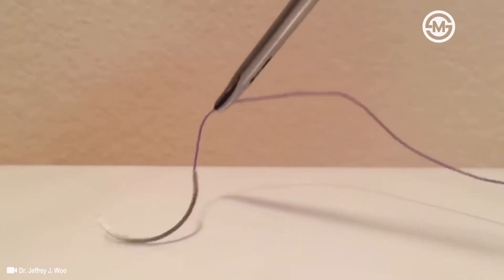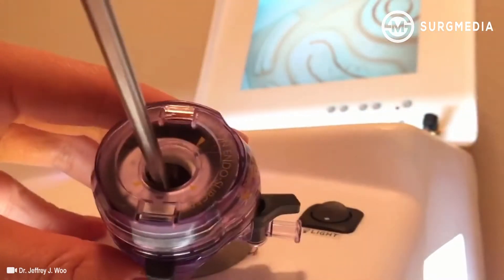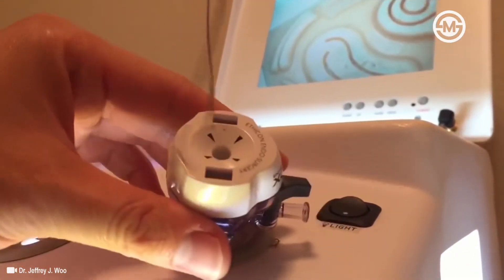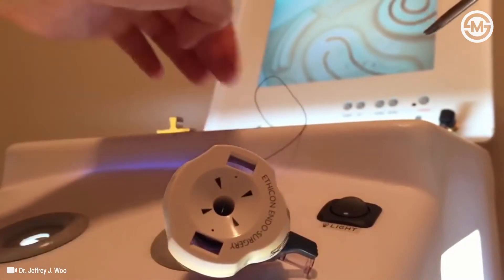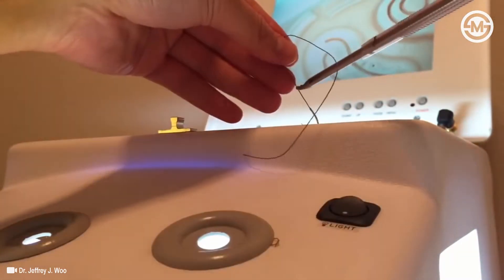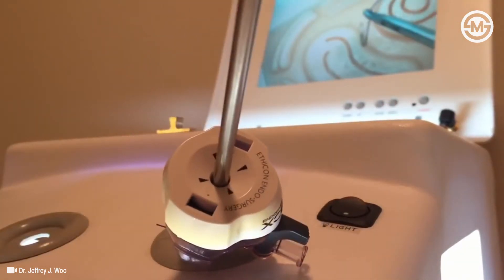First, grasp the suture at point A, about 2 centimeters from the needle hub. If you're working with a 10-12 port, you can directly insert the CT1 needle into the abdomen. When working with a 5 millimeter port, you won't be able to directly insert the CT1 needle. You will need to first insert the instrument through the trocar, then grasp the suture and guide the needle into the abdomen. This is called backloading the needle.